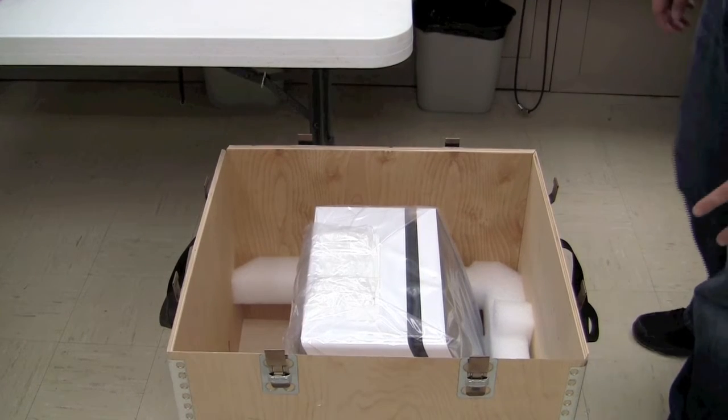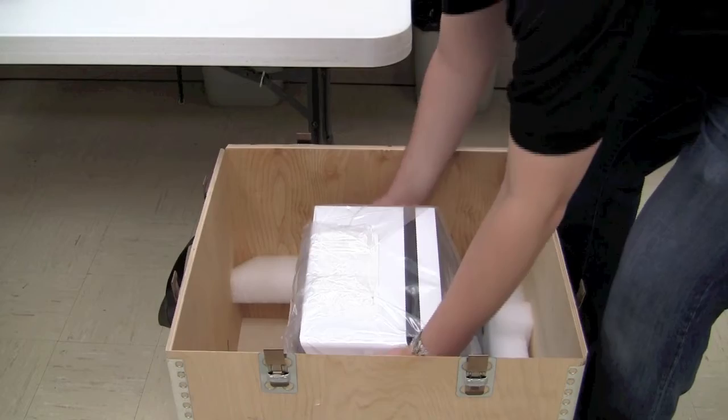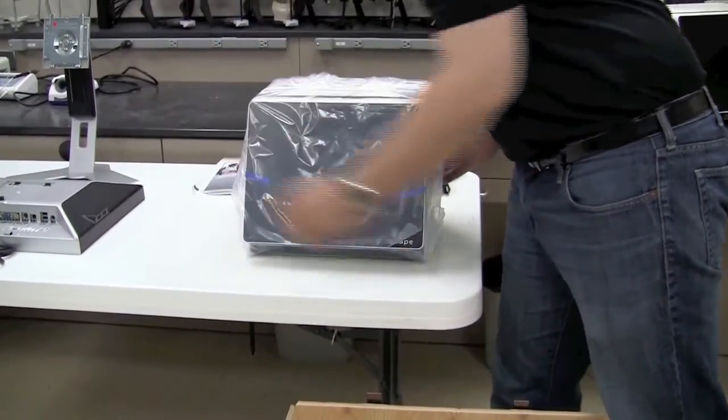The last item we're going to remove from the crate is the scanner itself. Simply grab it on both sides, get a firm grip, and pull straight up. We'll place the scanner facing outward on the table.